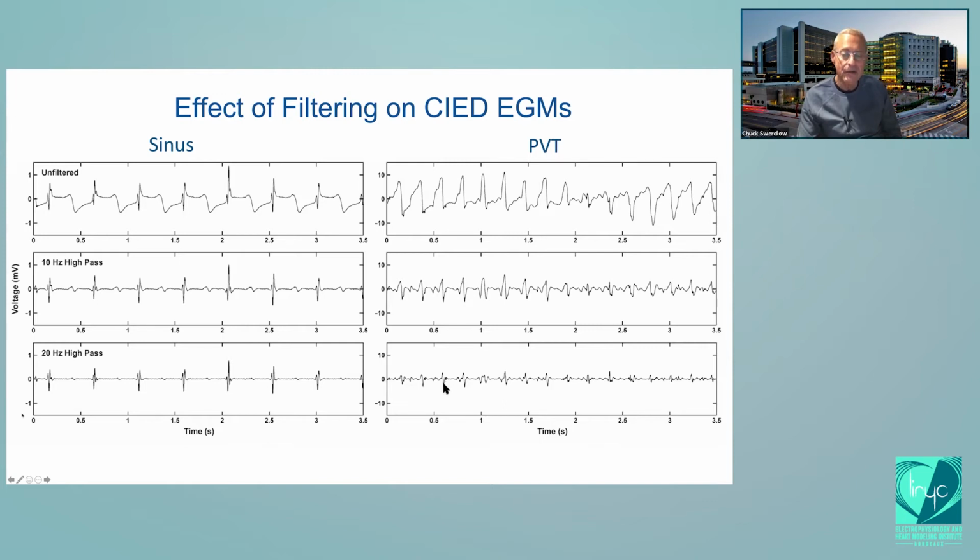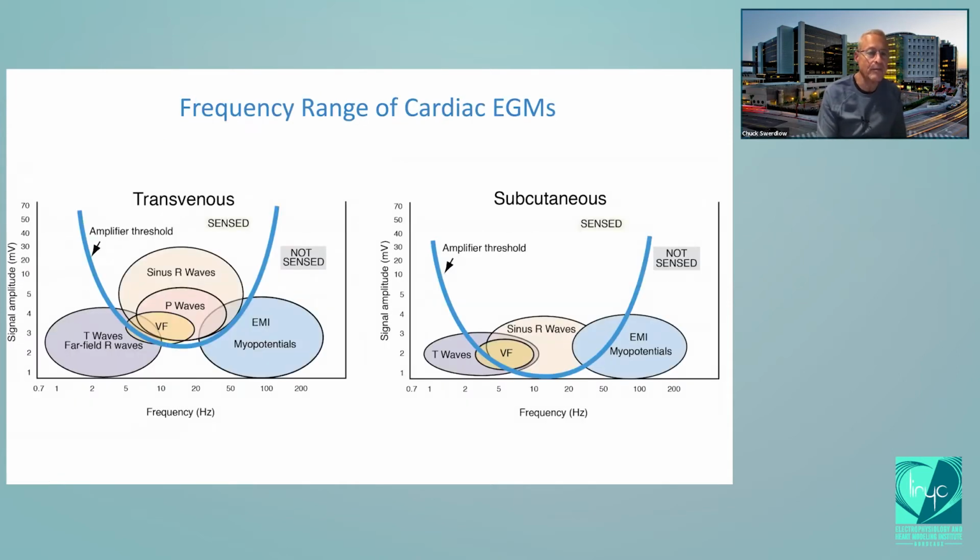And so it's important that defibrillators generally can't operate with the same high level of high pass filters as pacemakers. Defibrillators typically operate in the, say, 12, 14, 15 hertz range. 20 hertz high pass filters, which one company uses, pacemakers tend to use those. That's okay, because pacemakers don't need to see ventricular fibrillation. I mean, they can't do anything about it. They understand it's not a big deal. But this is an important concept, that you change the amplitude of the signal by high pass filtering it.